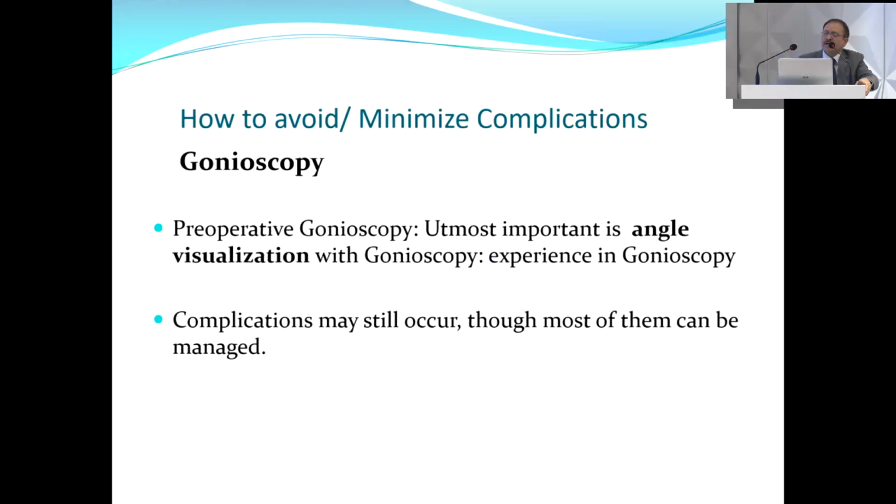So, how to avoid or minimize complications? One must be very well versed with the technique of gonioscopy and do the procedure only if you are seeing the structures, and don't go blind and just assume that you are doing the right thing. So, complications may still occur, though most of them can be managed.